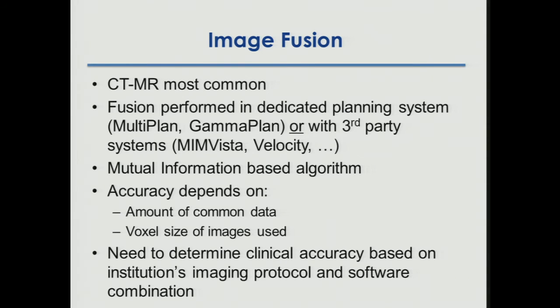And I think this is one of the big dangers right now. We are throwing 2 images in there, we let the algorithm fuse, we're checking a few parts of visible anatomy, but not everything, because soft tissue is hard to check at times. With MRI versus CT, you don't have clear landmarks. And then we trust what's on the screen there.